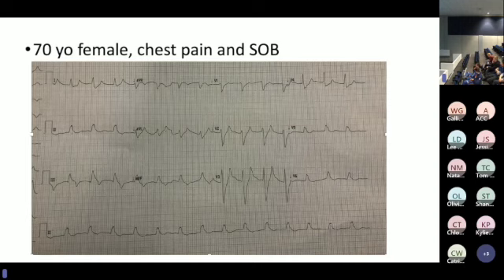So I think that on an overtime shift, the patient pulled an intern aside and said, I've got something to tell you. Actually took, I think it was 100 potassium tablets. It was like 2 or 3 bottles or something. But yeah, I agree. If you're on a night shift at Canterbury and you get an ECG like this with no story and no blood gas, this would be quite a tricky one.